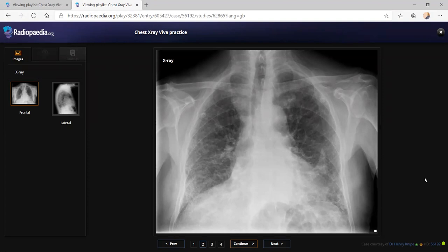Okay. So I'm looking for the possibility of any calcified pleural plaques, which is not very obvious in this image. The background lungs show some emphysematous changes. So I'm thinking of the possibility of maybe a pneumoconiosis. I'd like to suggest further evaluation with cross-sectional imaging, refer the case to the pulmonologist and suggest pulmonary function testing. Depending on the chest CT picture, we'll go ahead with the management.